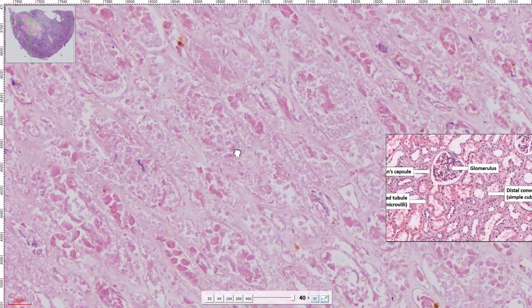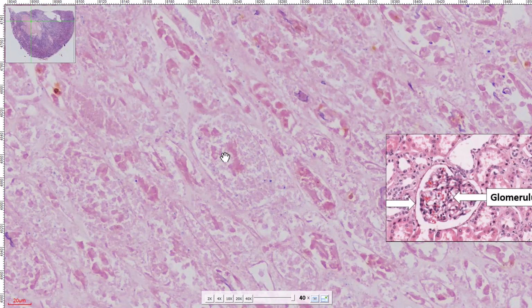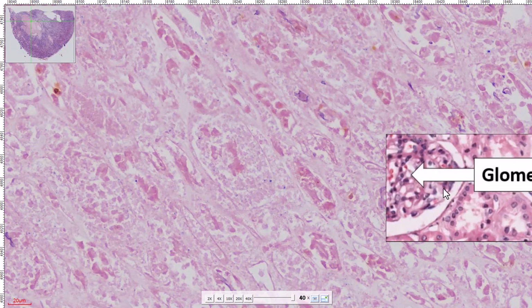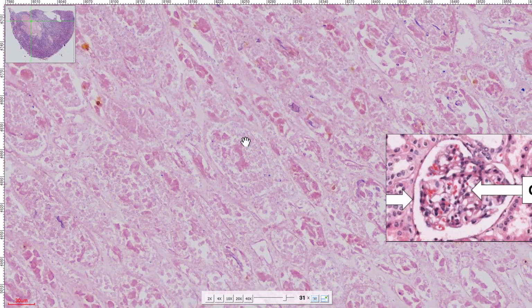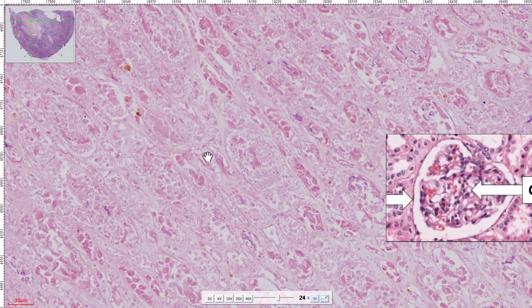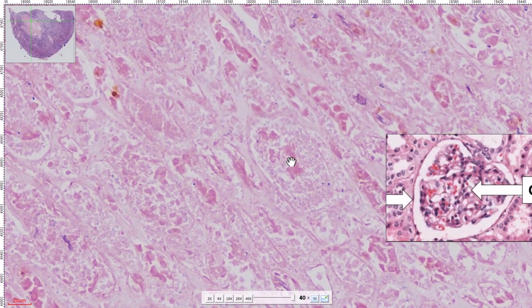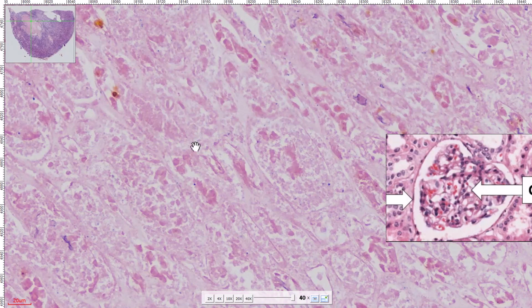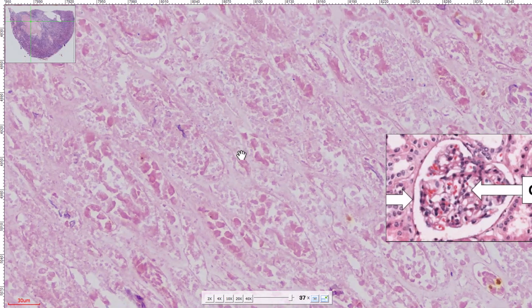So this is actually glomerulus, but it has undergone coagulative necrosis. Can you observe any of these black nuclei here? If no, then this is coagulative necrosis. I want you to be really familiar with the definition and concept of coagulative necrosis. We only have the outline of the structure, but the nuclei and granules, the organelles, are gone. We cannot see any nucleus. We only see the outline. This is coagulative necrosis.